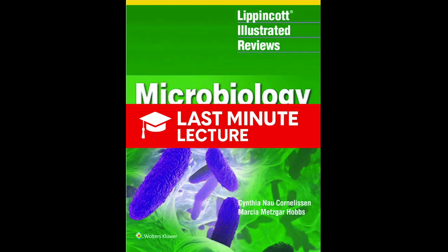Why wait for a culture when PCR can find the bug's DNA in a couple of hours? PCR, polymerase chain reaction. I think of it as a biological photocopier. That's a perfect description. You find one specific unique DNA sequence in the sample, and you make millions and millions of copies of it until it's easy to detect. And what's the big advantage here? Well, speed is one, but it's also great for bugs you can't grow easily, like viruses.